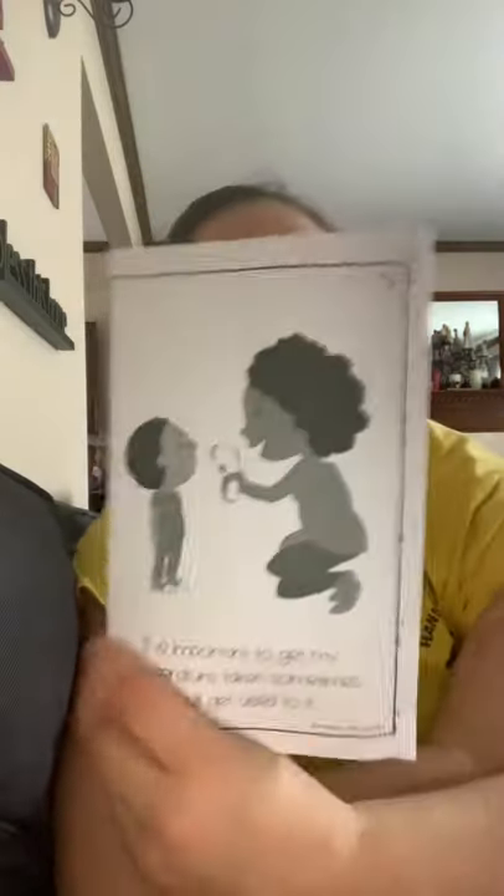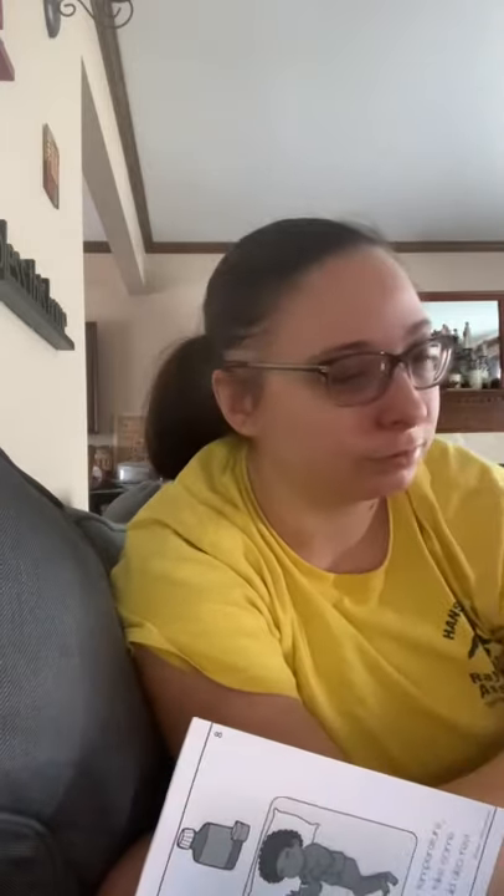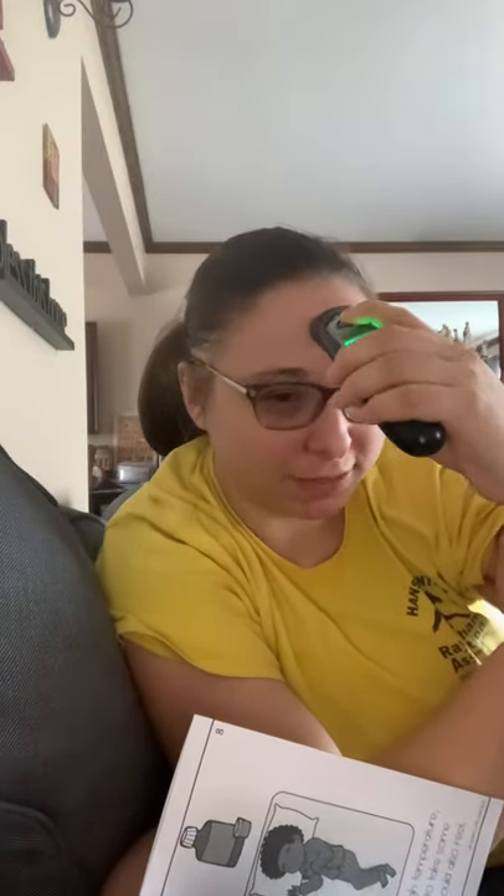It is important to get my temperature taken. Sometimes I will get used to it. Once again, if you guys want to practice with a forehead thermometer, get used to it — rub it around the forehead or practice with the beeps. Even Sugar sometimes has to get her temperature taken. All right, bye for now guys!